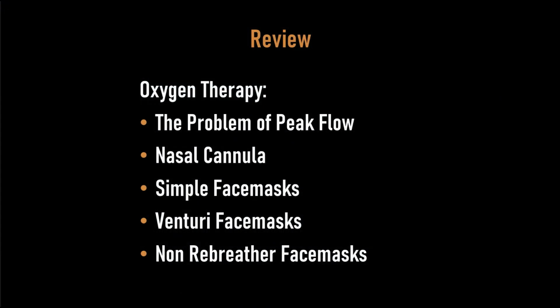Let's review this tutorial. In the tutorial, I covered oxygen therapy. This was the first of 3 talks on this particular topic. We discussed the problem of peak flow and then moved on to a discussion about different devices. The variable performance devices, they are nasal cannulae and simple face masks. And then we looked at fixed performance devices, Venturi face masks and non-rebreather face masks. And I looked at the pros and cons of using all of these different devices.